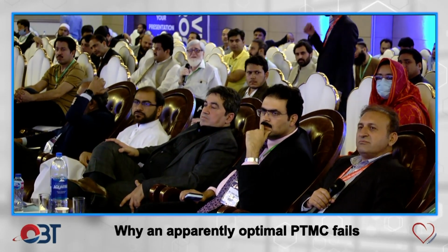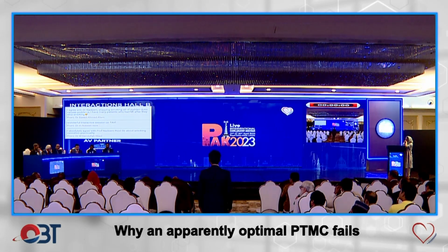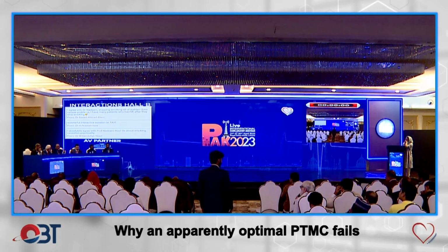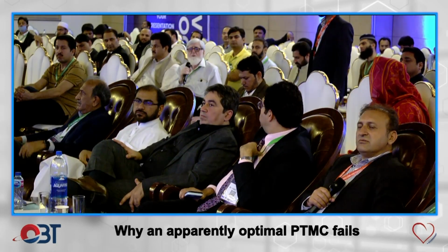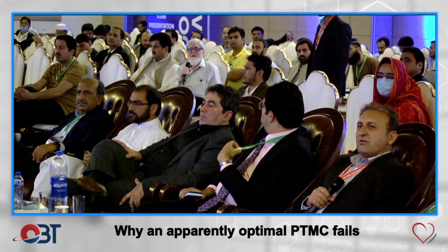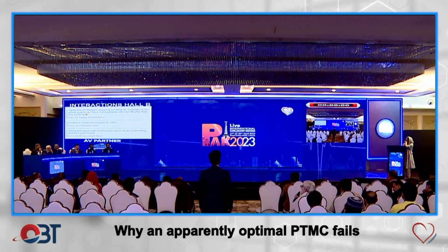Yes. So without giving an injection in the LV, how do you realize that I'm not at the right position and I must pull back a bit and then dilate it? You can see the mitral valve. Yeah. And you were monitoring the gradients as well at that time, that they're not going down, so this is the reason you thought probably you're not in position?